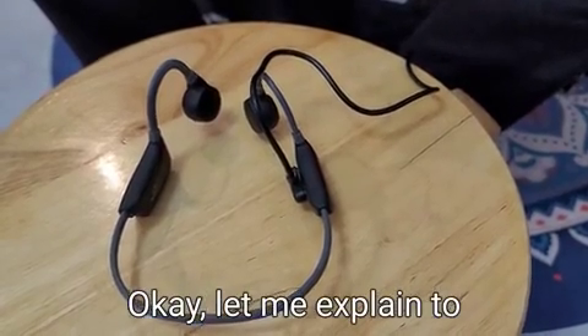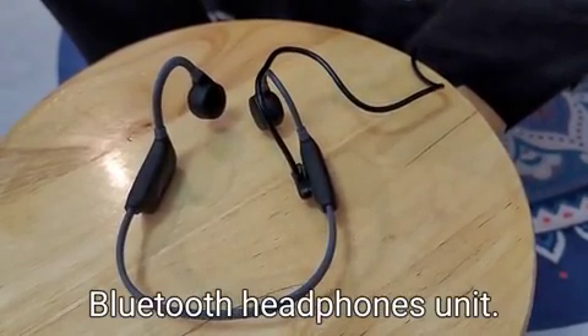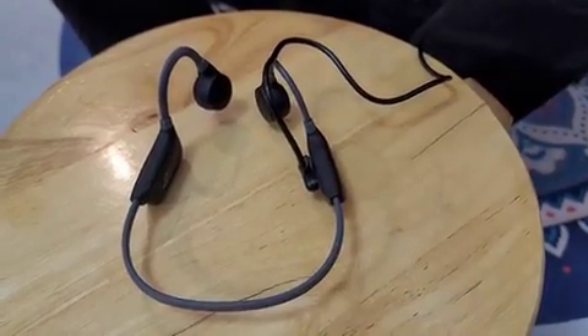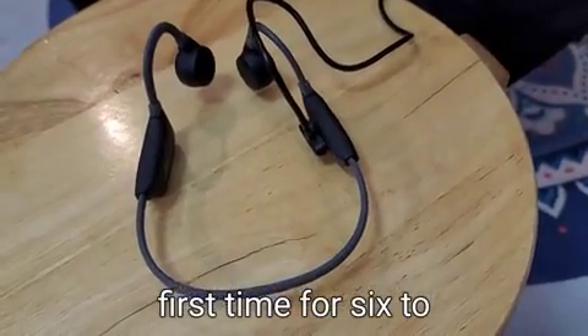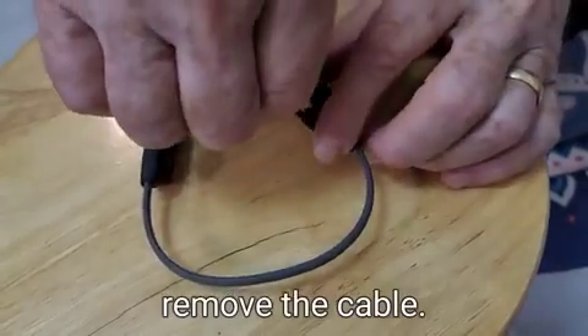Let me explain how to operate the hearing aids and Bluetooth headphones unit. First, make sure to connect the magnetic cable and keep it charged the first time for six to eight hours. When it's fully charged, remove the cable.